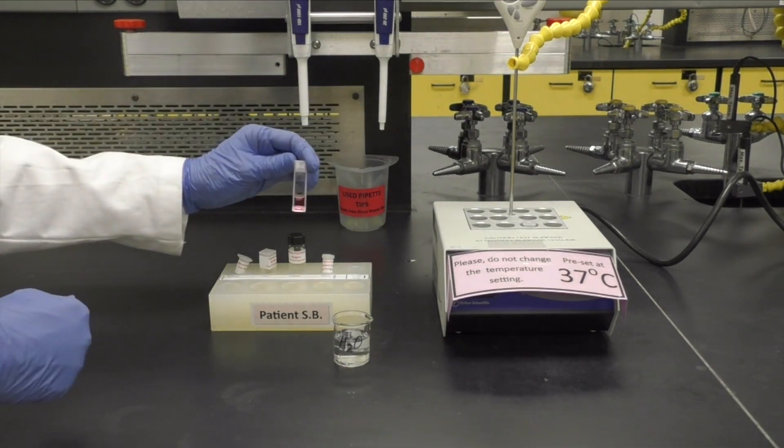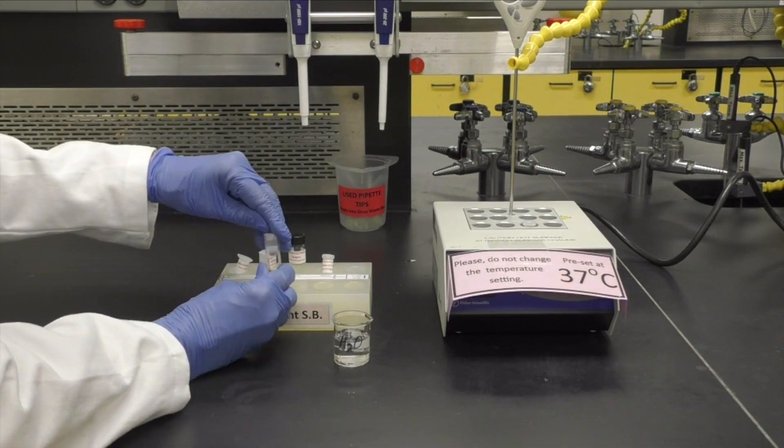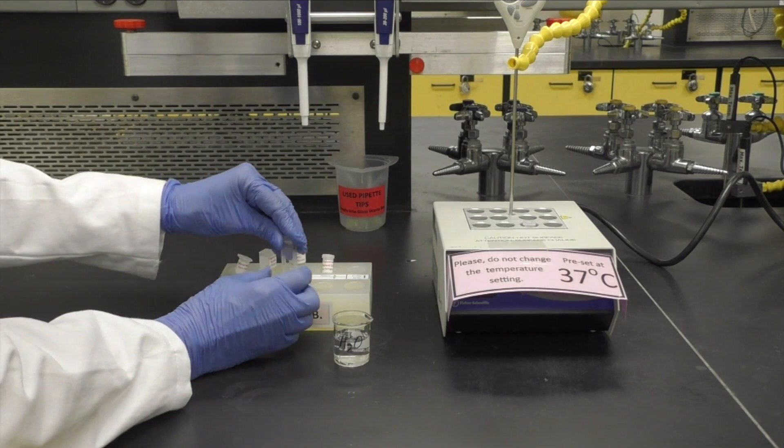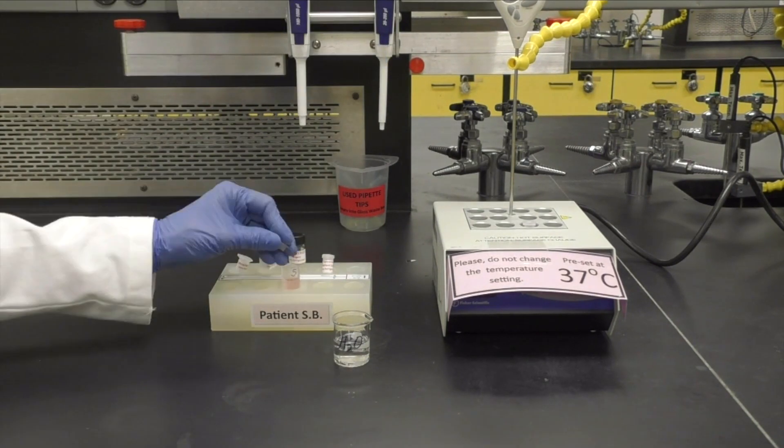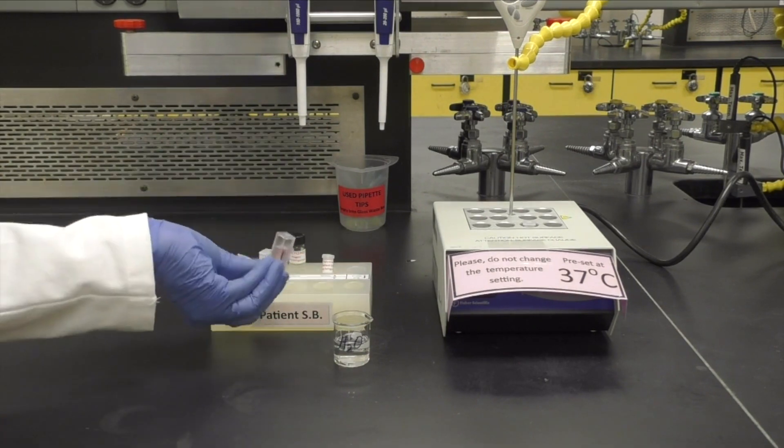Once 10 minutes has elapsed, remove the standard from the dry bath. Uncap it carefully and add 2 milliliters of Nanopure water. Cap it and gently mix by rotating.